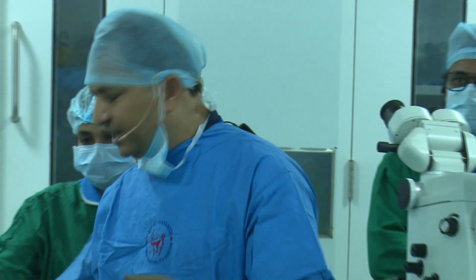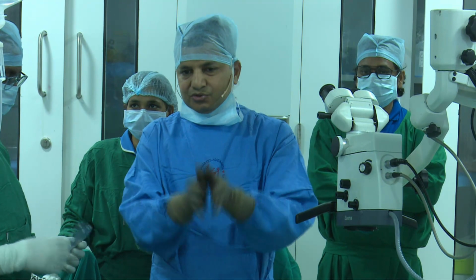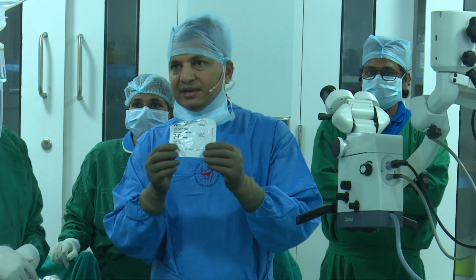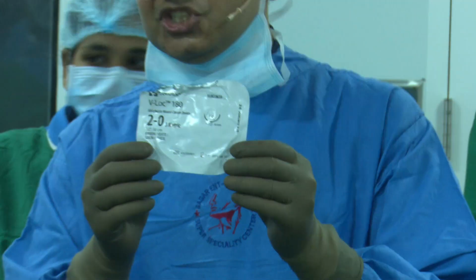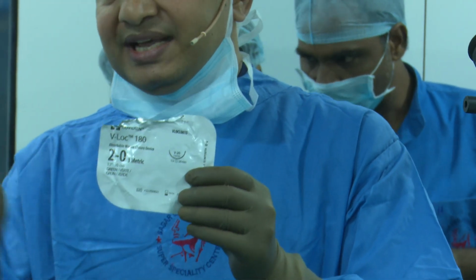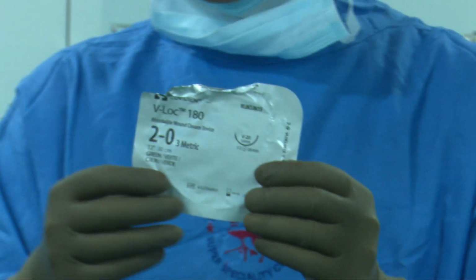There is already a paper published last year, sir, so you can safely use it, because we have published a paper, so legally you can use it. And this was the absorbable one. This was recommended to us by Professor Vicini, what he uses in Italy. So I started with this, but obviously it will last only 3 to 4 months, so I shifted to non-absorbable.